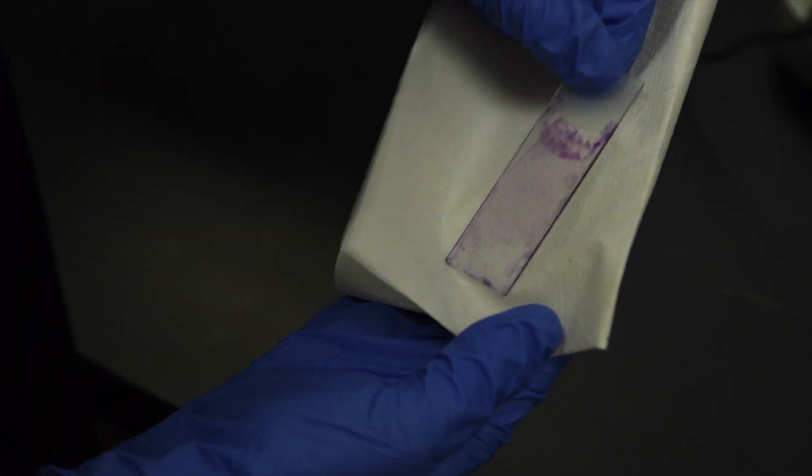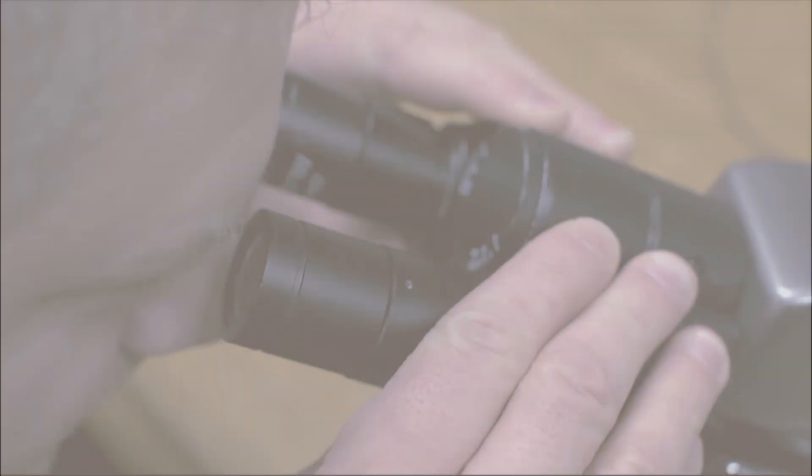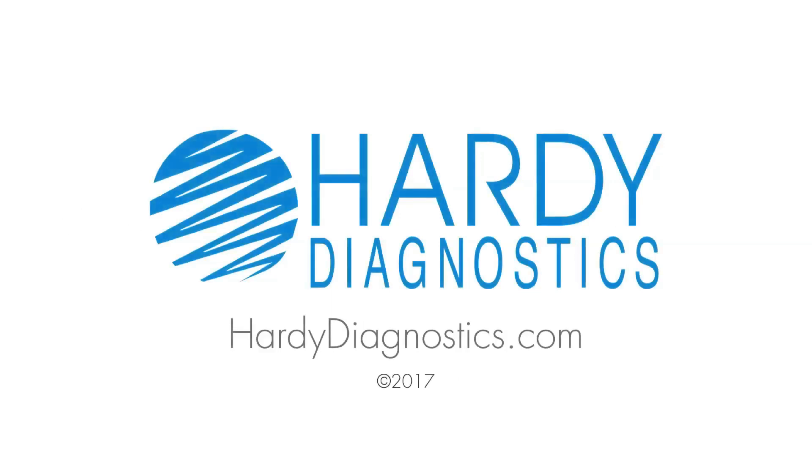Wipe the backside of the slide and let it completely dry before viewing the slide under a microscope.